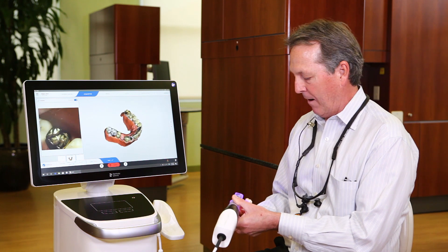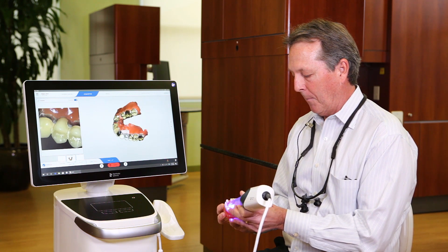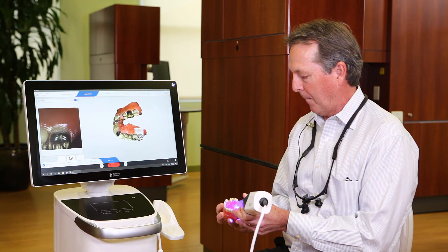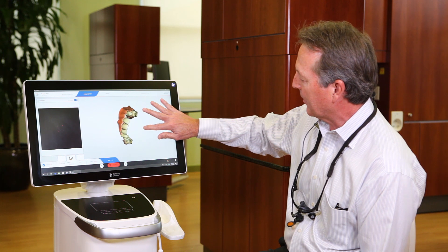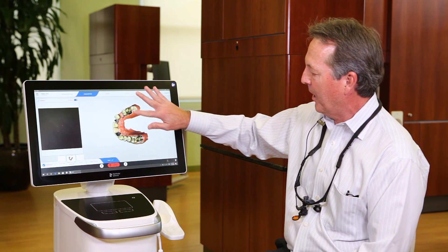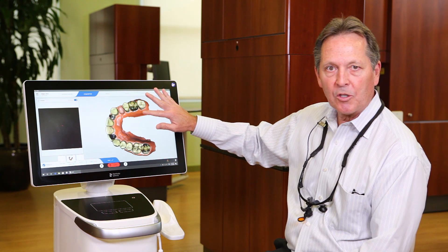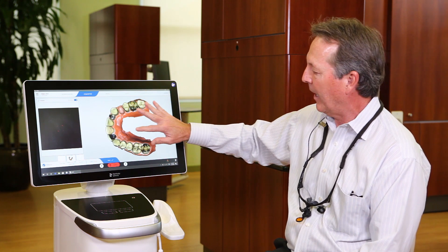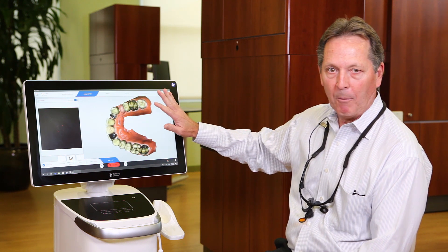Here's my model after just a couple seconds of scanning. Let me fill in a couple spots here. You'll see that it just did an absolutely fantastic job picking up the gold — no problem, no specs like we're used to seeing where we have to fill in spots that aren't getting filled in. Here's the metal lingual, the PFM — absolutely no problem.